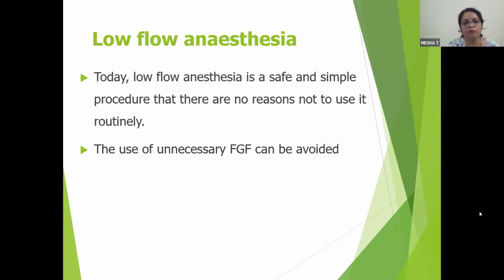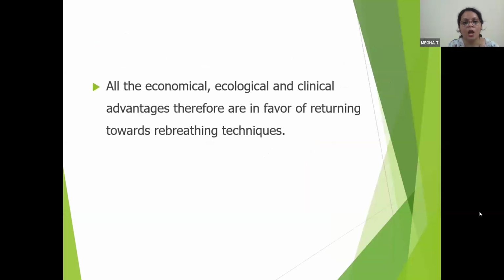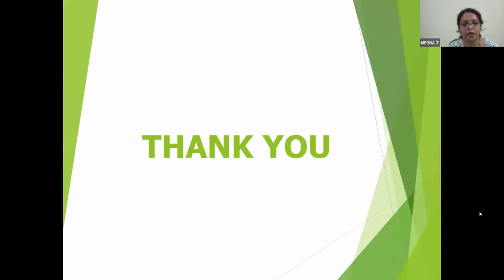So to conclude, low flow anesthesia today is safe and simple, and there is no reason not to use it. The use of unnecessary fresh gas flow can be avoided. We can reduce anesthetic gas consumption by up to 75%, and also the greenhouse effect caused by the emission and its impact on the ozone layer. So all the economical, ecological, and clinical advantages favor the rebreathing technique. Thank you.